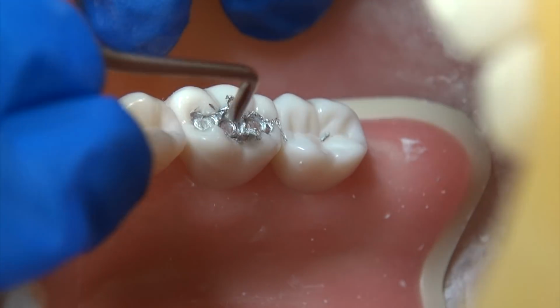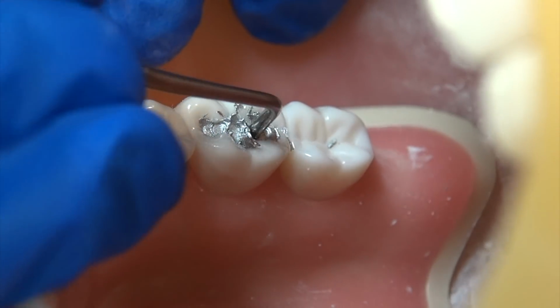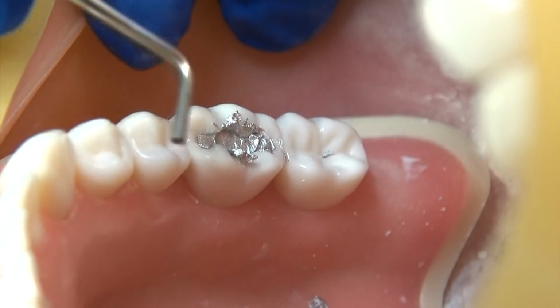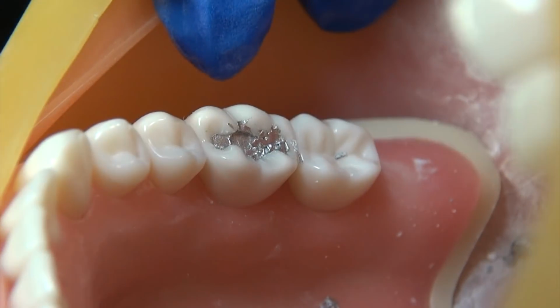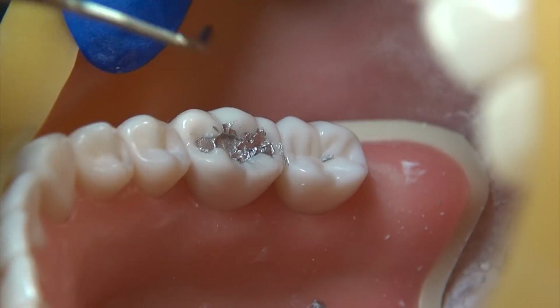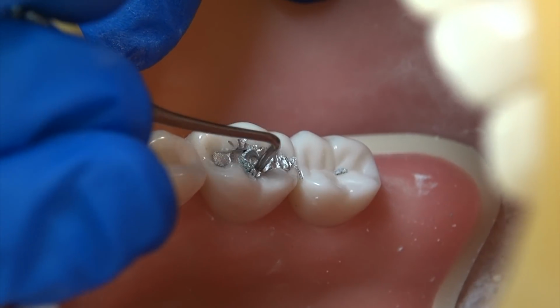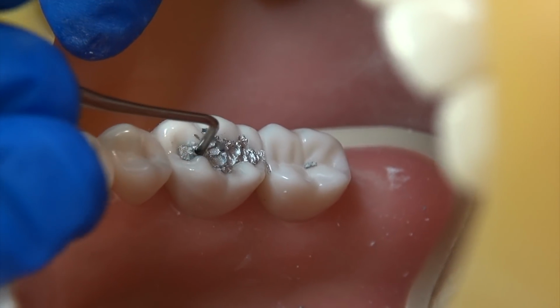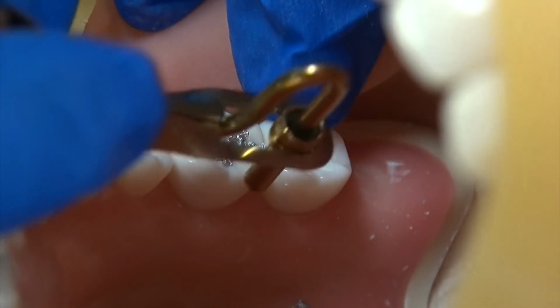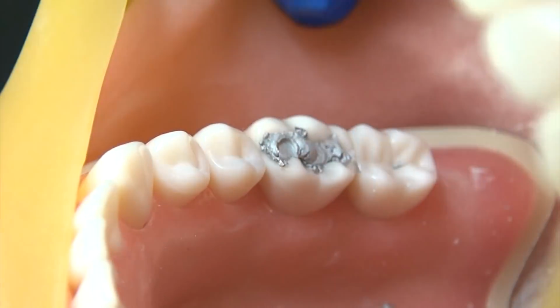So at first you can kind of just aggressively pack. Once you get it aggressively packed, then you can come back and do a walking motion. And if some falls out, that's okay. And then you can even move to the even smaller nib. This is 0.7. You can see how I'm doing that walking motion again. Real important that you keep doing the walking motion and going progressively smaller in the condensers.